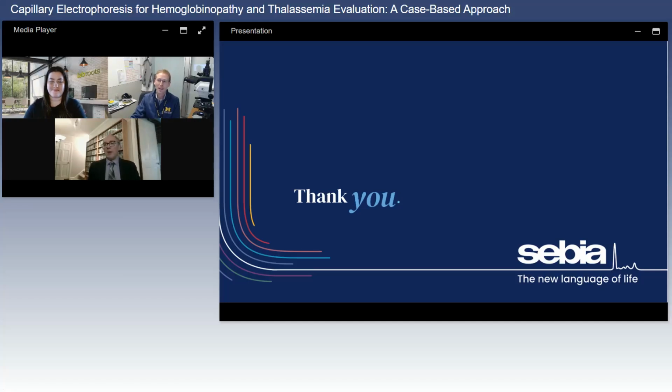That's okay. I believe they are fairly close. I think they're a little more separated on HPLC, so it may give you a little bit better of an estimate in that very specific case. But that's simply the nature of the hemoglobins and where they happen to migrate or elute. So to summarize S and D on capillary, you cannot really separate them for an accurate quantification of the two of them. You'd probably highlight the entire peak as a single peak and report it as hemoglobin S plus hemoglobin D percentage.